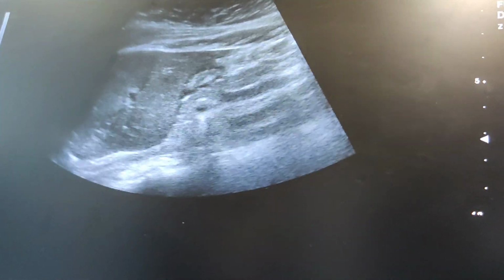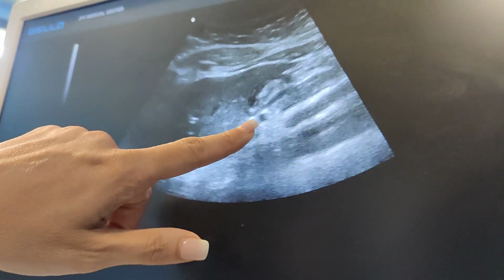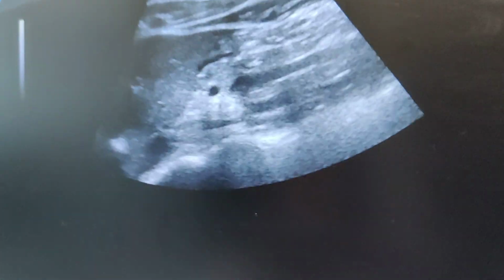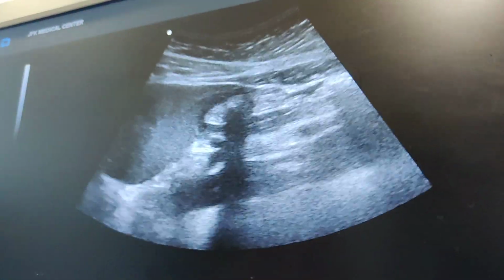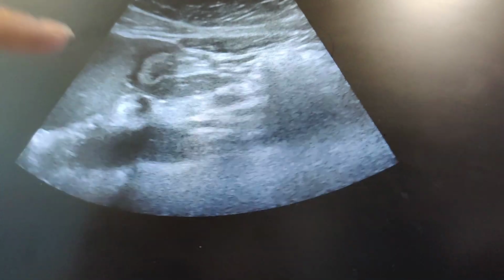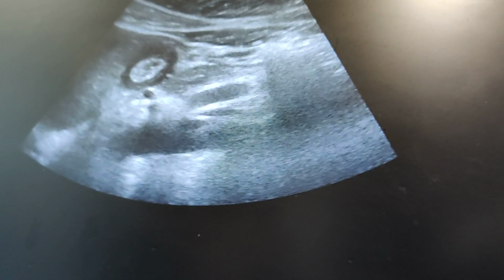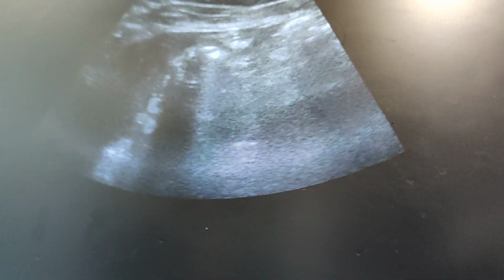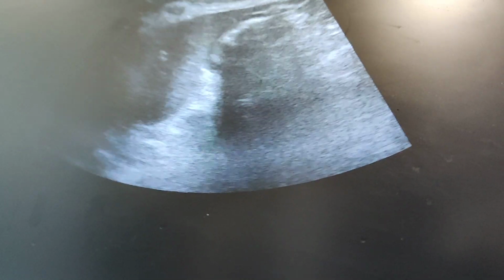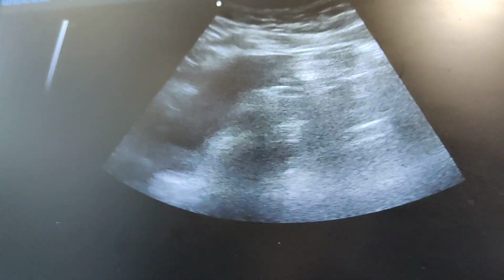When I want to scan liver, I start in the sagittal position, almost the same place. We can see the pancreatic head is here. We don't normally measure the pancreas unless the head looks really enlarged, then we might measure it. Sometimes you'll get the pancreatic duct in here. So if you see it dilated, you can measure it. And then we go to the liver. I want to say 3 millimeters, but I'm not sure.